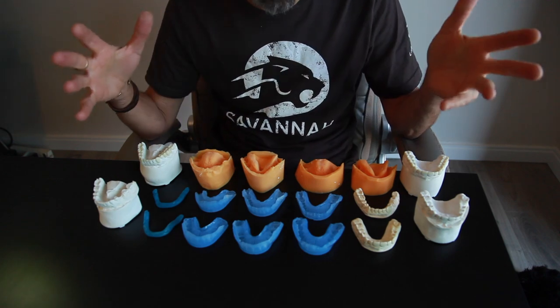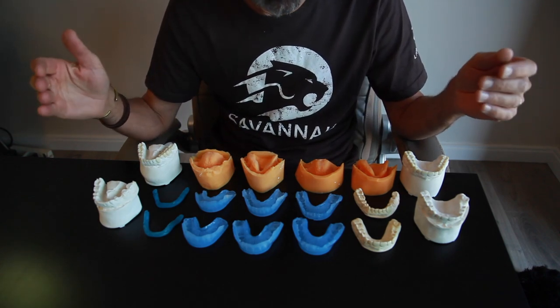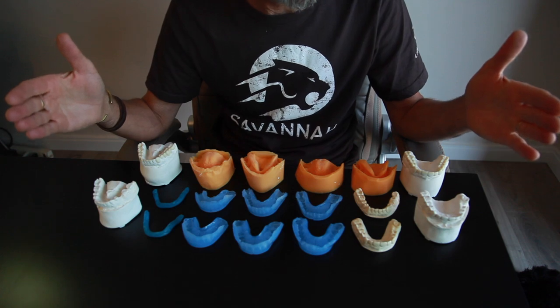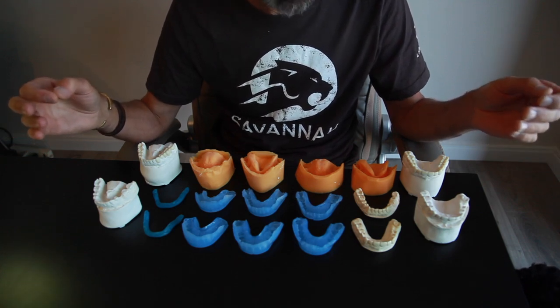Here we have the complete case ready to go back to the dentist's office. We have our toolkit here. This is what a case basically looks like when we do a full mouth rejuvenation. This will be minimally invasively done — it's all going to be additive composite.